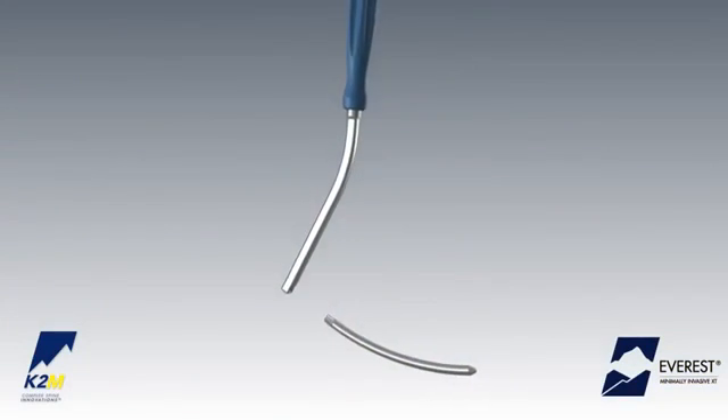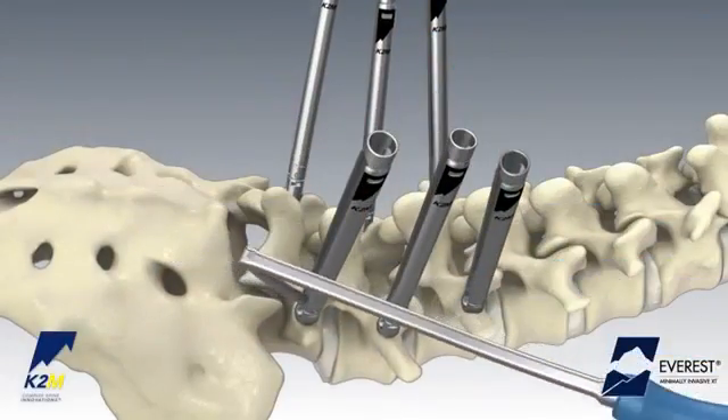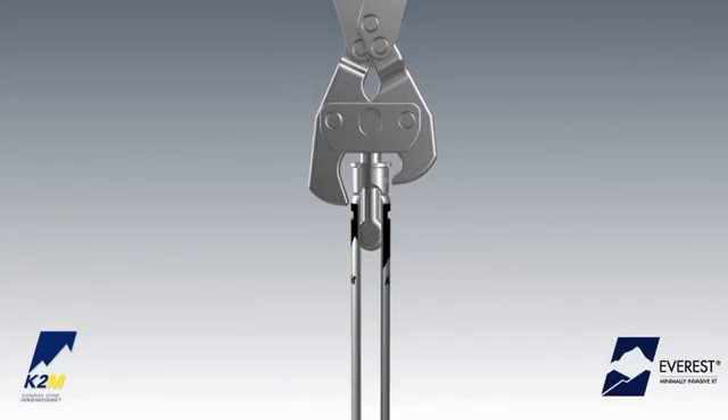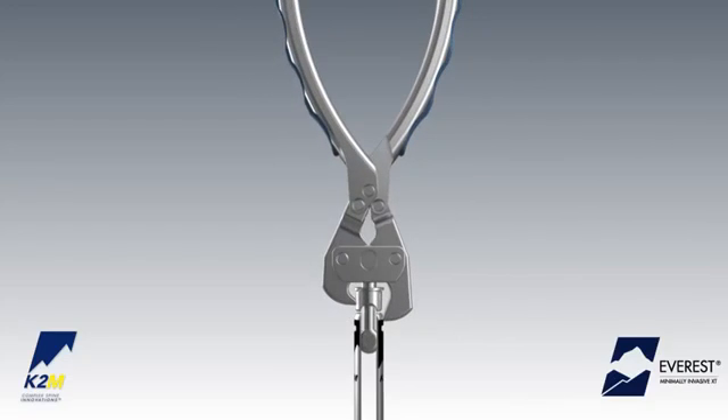Load the hex end of the rod onto the rod inserter and secure by fully tightening the dial. Insert the rod by using the tapered tip to slide through the muscle tissue from screw head to screw head. The XT screw also allows the closed top cap to be removed to facilitate open tab rod passage if preferred.